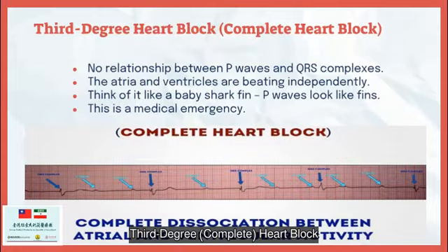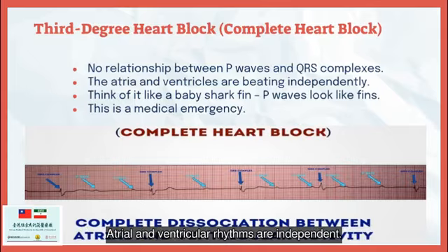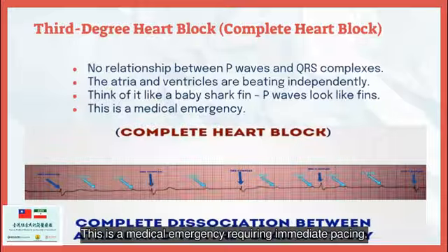Third degree, complete, heart block. P waves and QRS complexes are completely dissociated. Atrial and ventricular rhythms are independent. This is a medical emergency requiring immediate pacing.